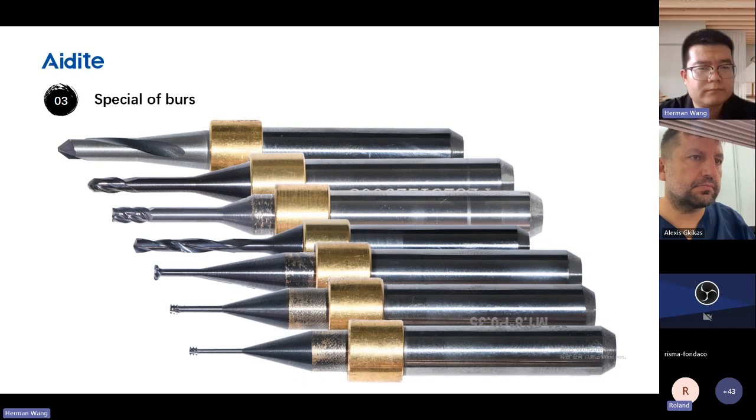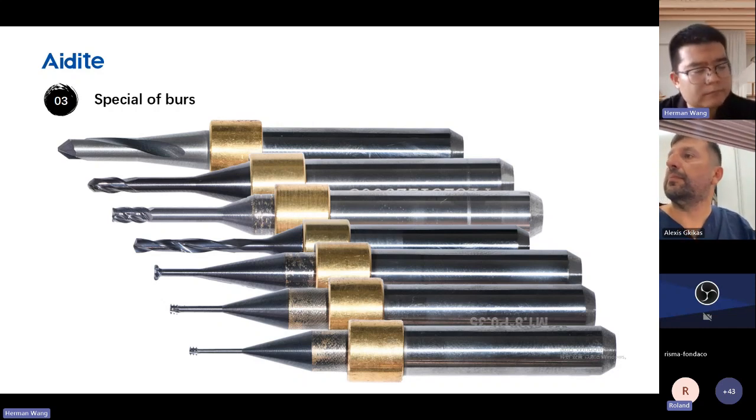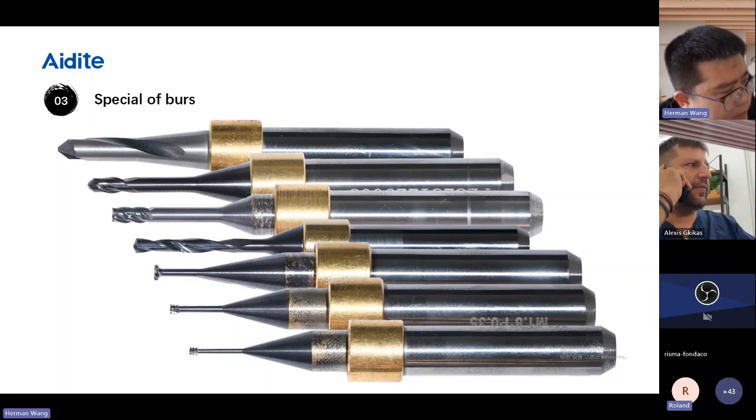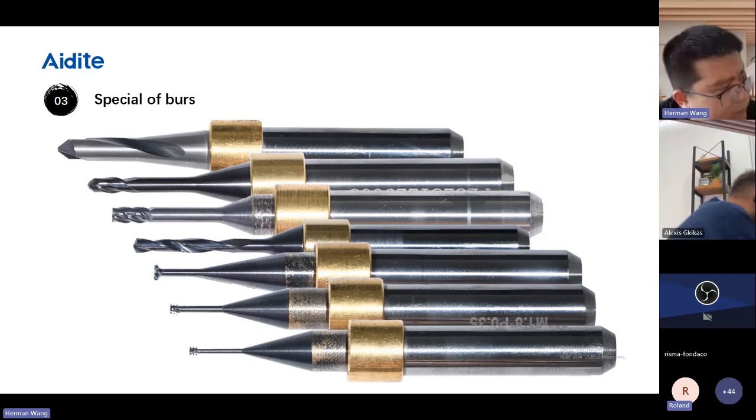So okay, my question: when you do metal milling, you are actually choosing the wet mode, right? Wet milling mode, right? It's not the dry milling mode, right? Because of a high temperature requirement.